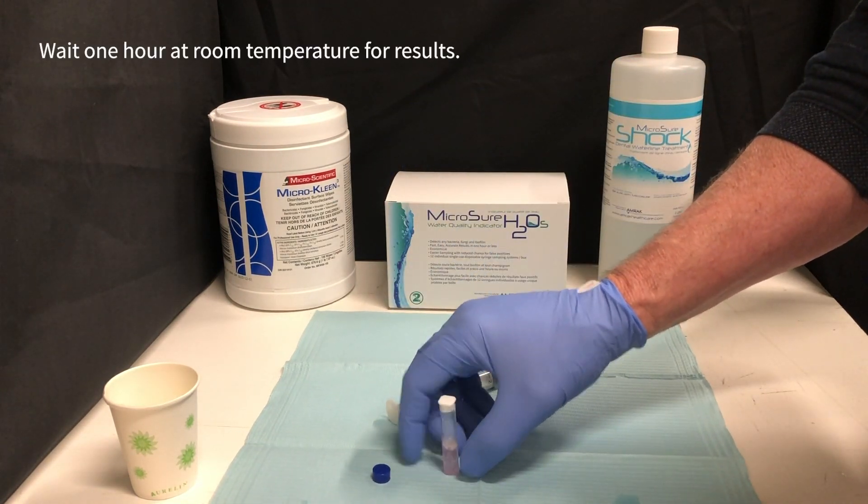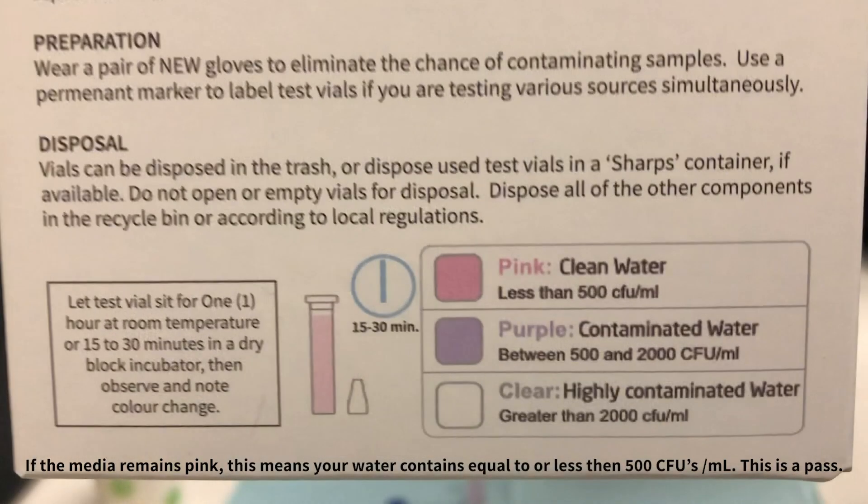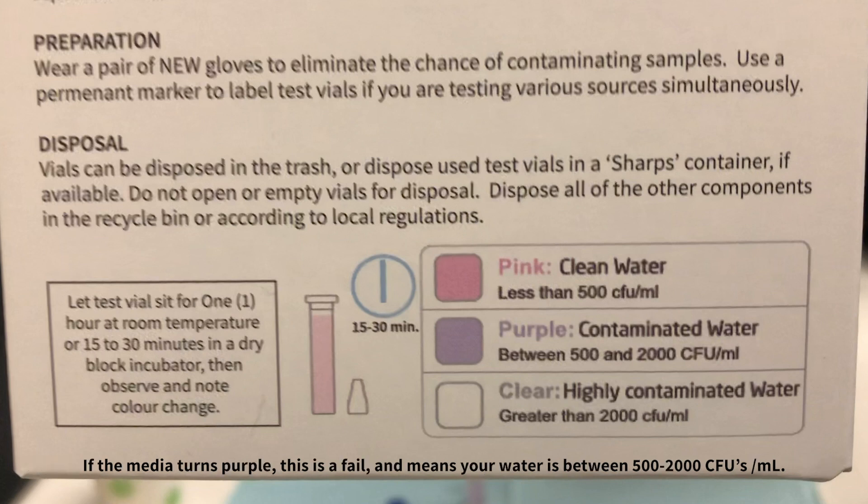Wait one hour at room temperature for the result. After one hour, if the media remains pink, this means your water contains equal to or less than 500 CFUs per milliliter — this is a pass.